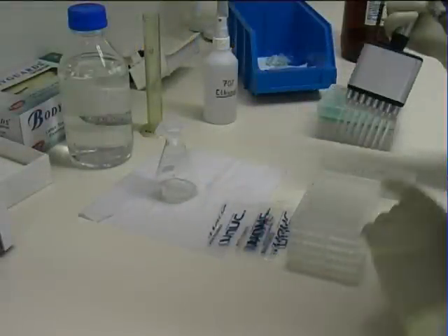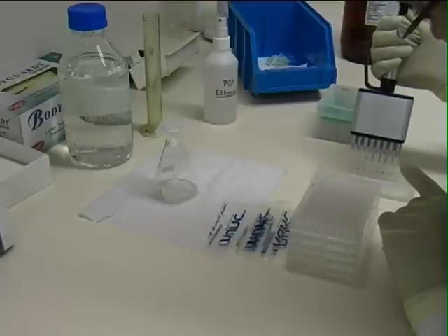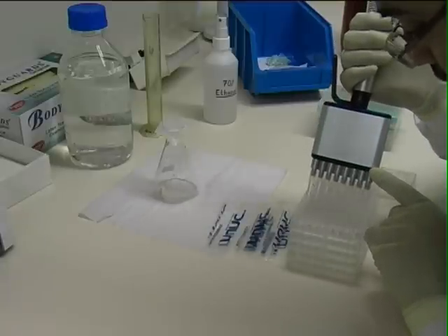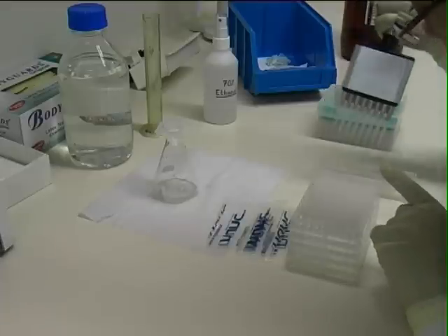Before we start the assay, it's necessary to coat some flat well plates with goat anti-mouse IgG diluted in coating buffer. We prepare the plates in bulk and keep them in the fridge for up to two weeks.